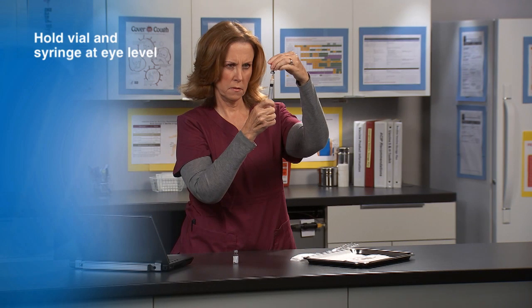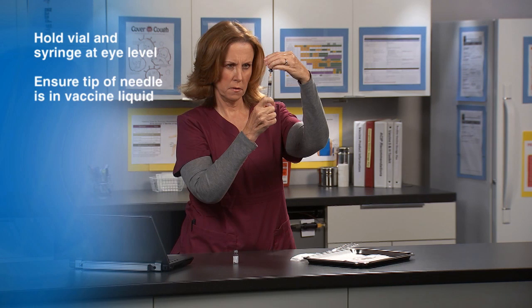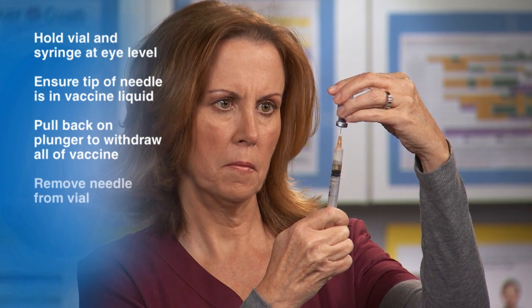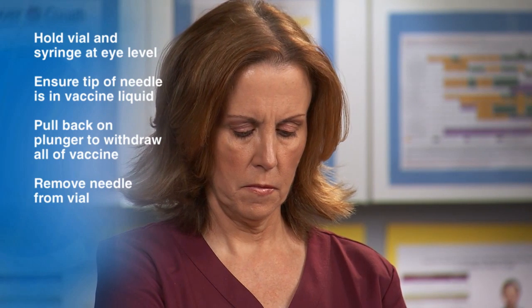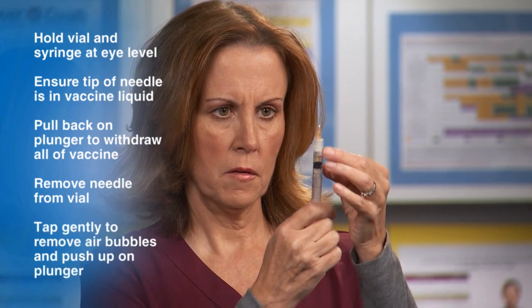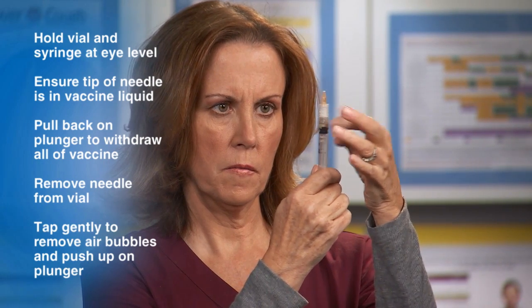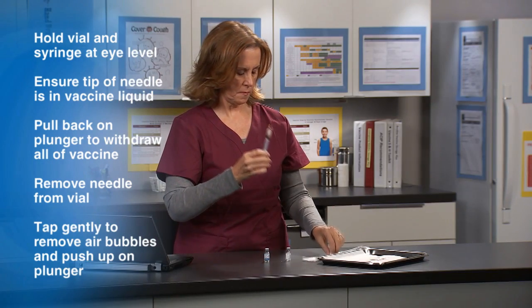With the vial and syringe at eye level, ensure the tip of the needle is in the vaccine liquid. Pull back on the plunger to withdraw all of the vaccine. Next, remove the needle from the vial. To release any air bubbles, tap gently on the barrel of the syringe and then push up on the plunger, being careful not to expel the vaccine.